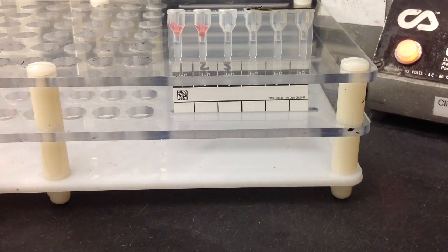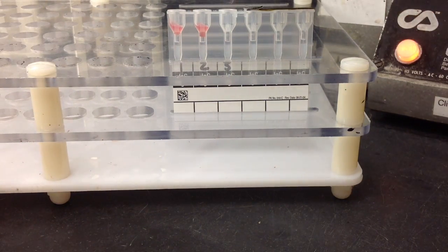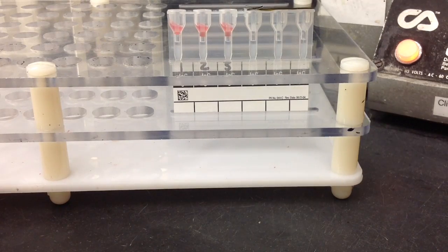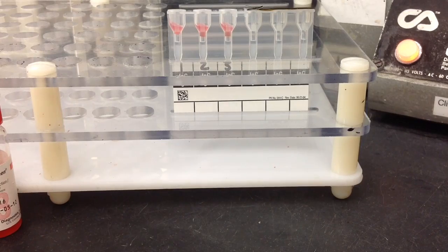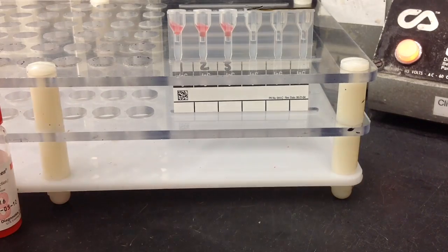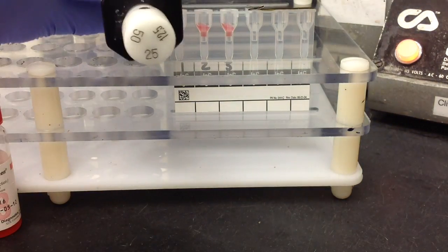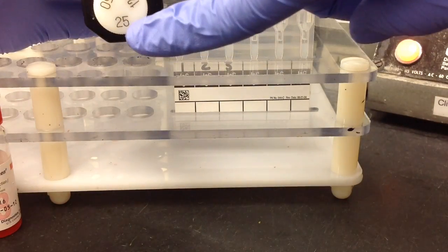After adding your reagent red cells in the upper portions of the reaction chamber, then you can start to move on to the patient specimen, which will be their plasma or serum, and you're going to want to use a 25 microliter pipette for this.